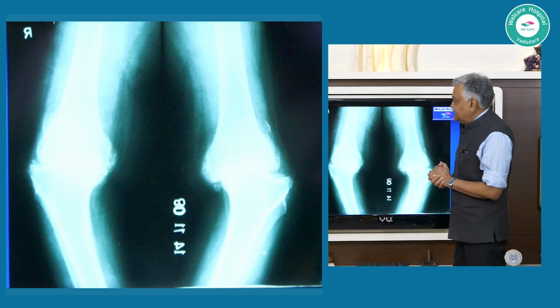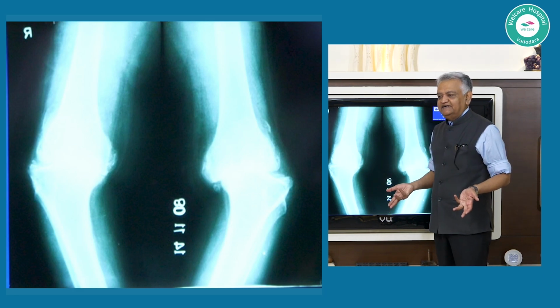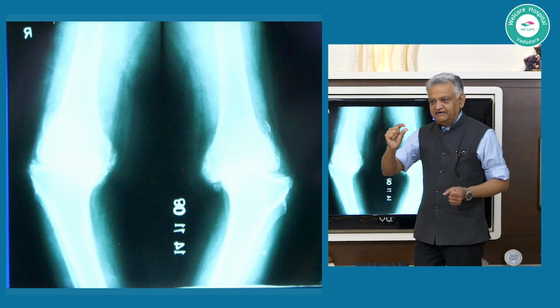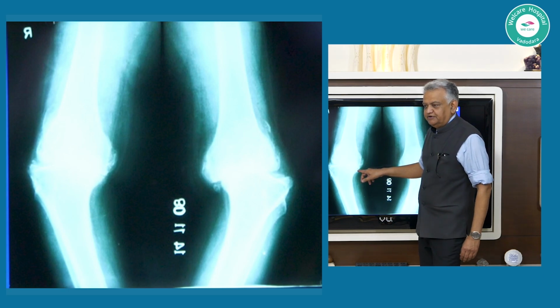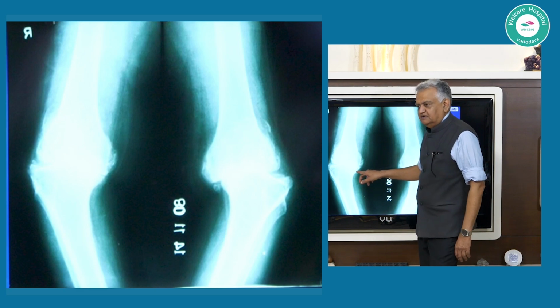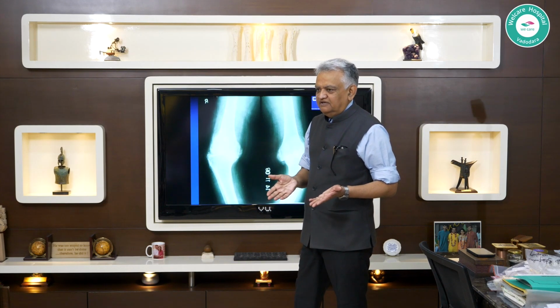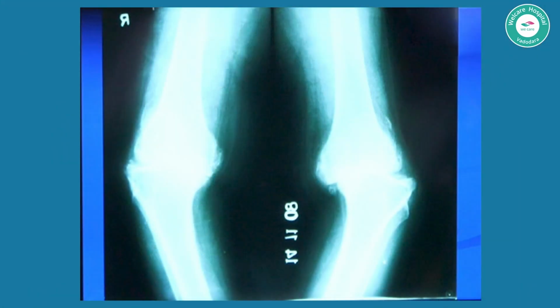Now, to answer your question, the bone loss is going to be compensated the moment you put your tibial tray insert. For example, if there is an 8 millimeter excavatory defect, or even a 10 millimeter excavatory defect, almost 90% of that bone loss defect is compensated the moment you put your artificial component of minimum 8 millimeter thickness, but usually maybe up to 10.